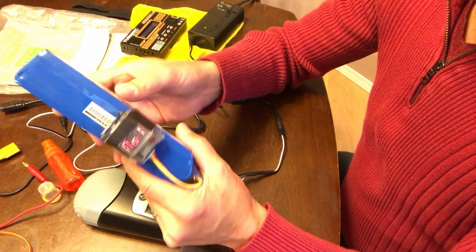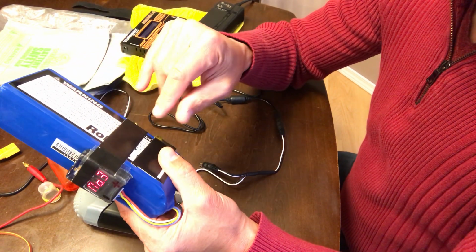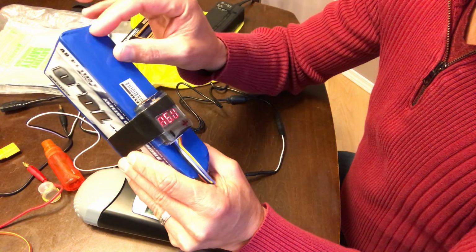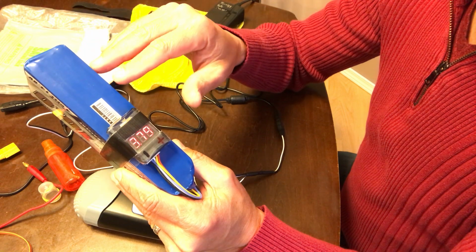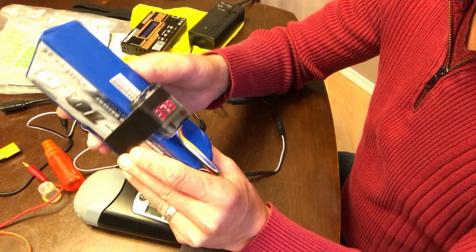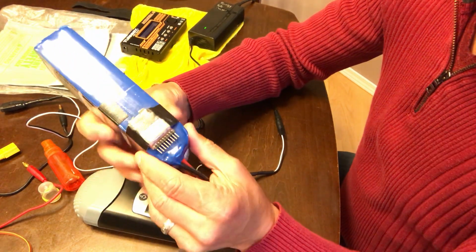Now, something about these batteries, since they're lithium polymer batteries, they do die. So if that cell goes below a certain voltage, say it's around 3.0 or 2.9 or something, it can fry. It turns into a brick. So you don't want to do that. So the other thing I did was I added another device here.